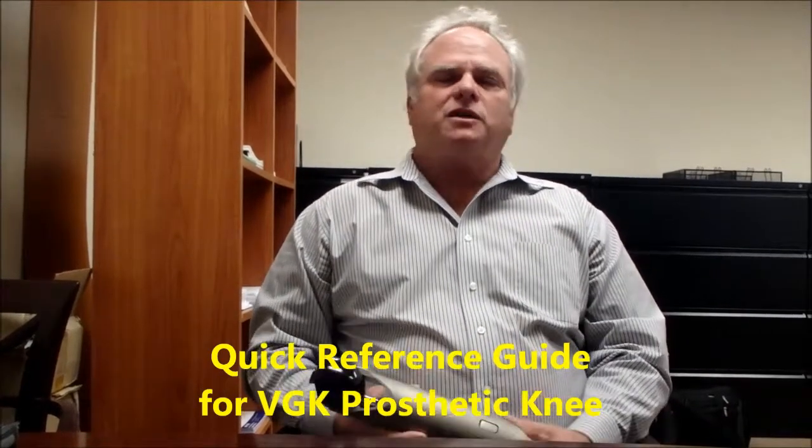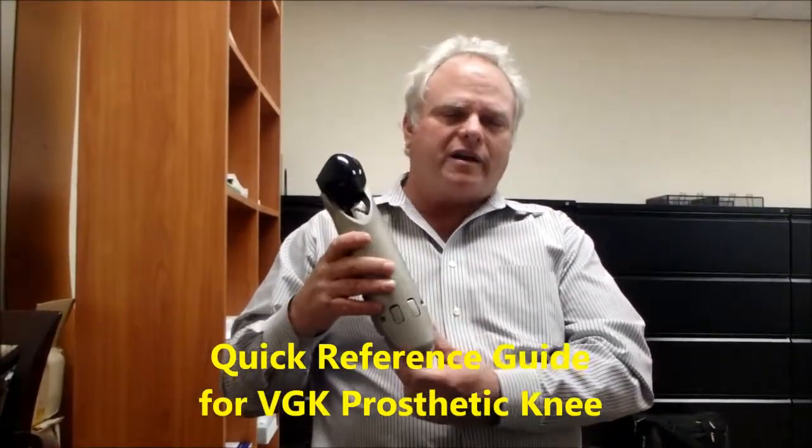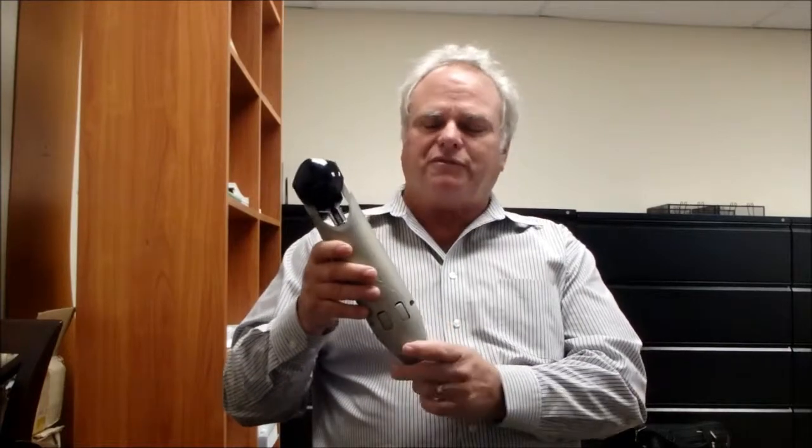Hi, I'm here today to talk about the quick reference sheet for the VGK knee. It's a very simple knee, there's not a lot to be adjusted, but at times it can be confusing.